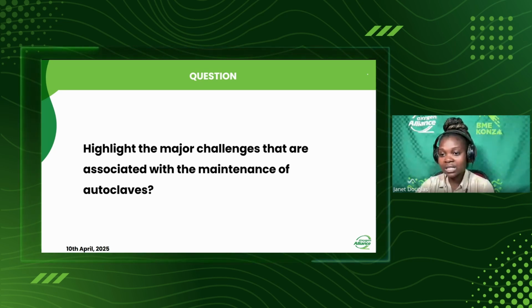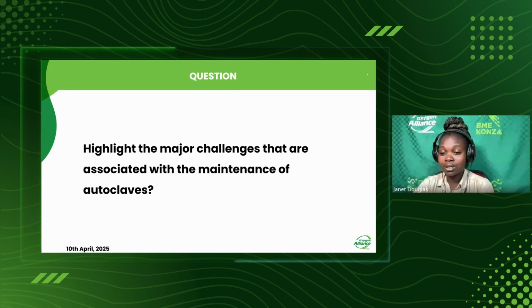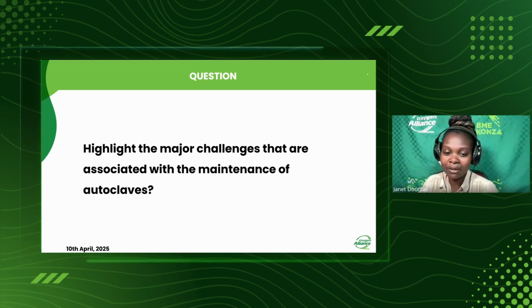For high pressures, we didn't get to check because the autoclave exploded in the theater. For the shock, it was loose contact touching the body of the autoclaves. I can't really talk much about the overheating and the pressure that caused the explosion. I would love if we could discuss the possible causes. So I'm posing this to our engineers. This is a student who went through an internship and then experienced an explosion of the autoclave. She went through shock, there was also high pressure and overheating. So she just wants to understand what could have been the possible causes of this scenario.